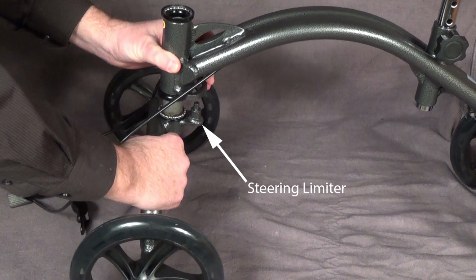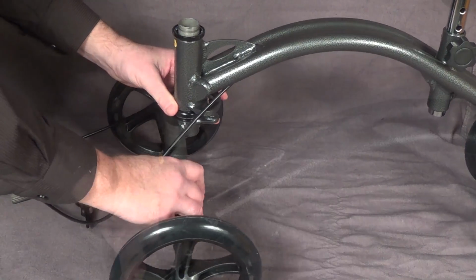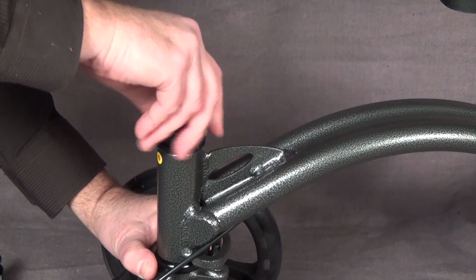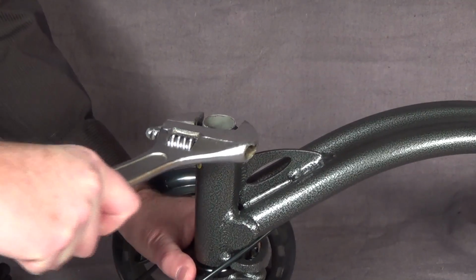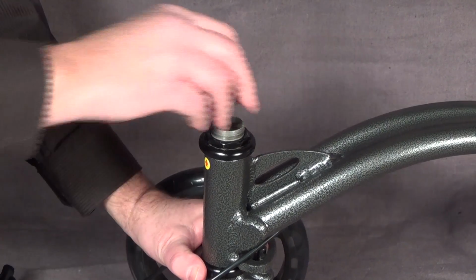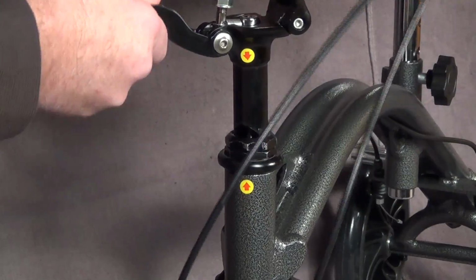Make sure the steering limiter goes into the steering limiter bracket. Reinstall the adjustable race and the lock nut onto the frame. Reinstall the tiller onto the frame.